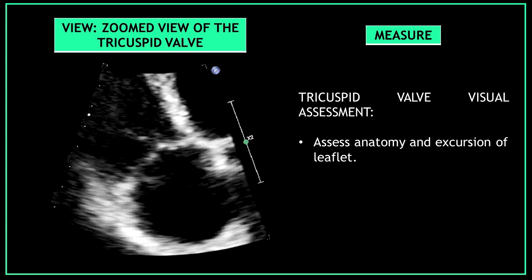Now obtain a zoom view of the tricuspid valve and perform a tricuspid valve visual assessment. Assess the anatomy and excursion of the leaflets.